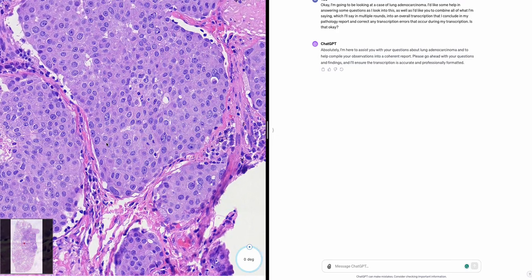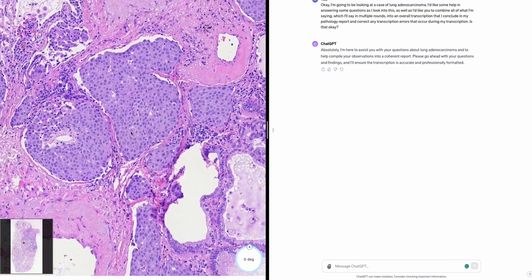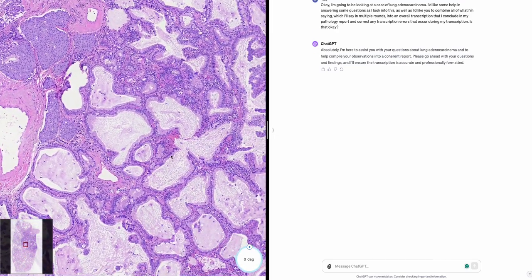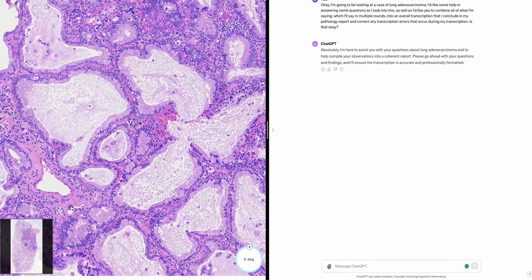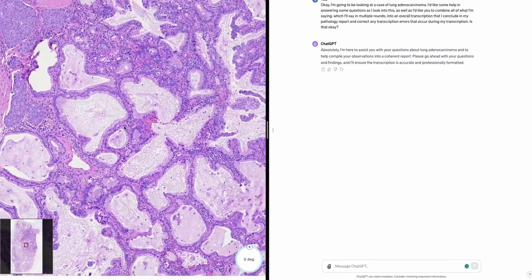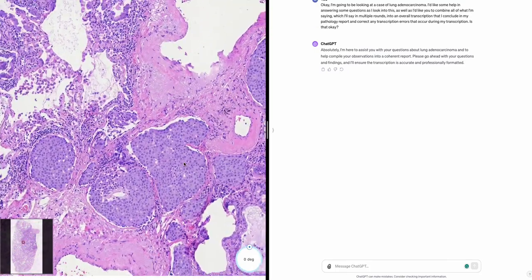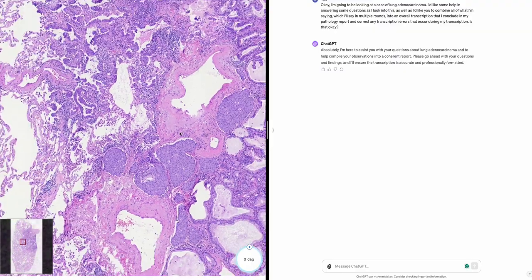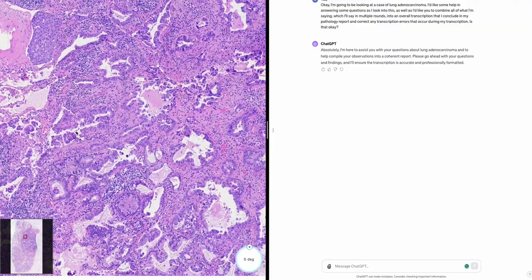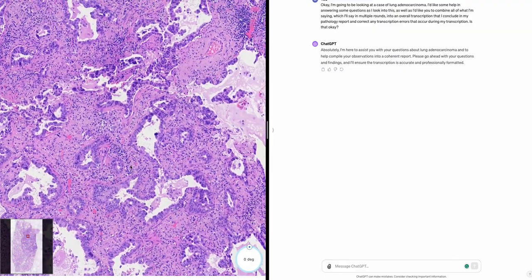Two, the solid pattern, which shows solid nests or sheets of tumor cells with abundant cytoplasm and prominent nucleoli. It may have mucin production but less than in mucinous adenocarcinoma, and the solid pattern is also linked with a worse prognosis.